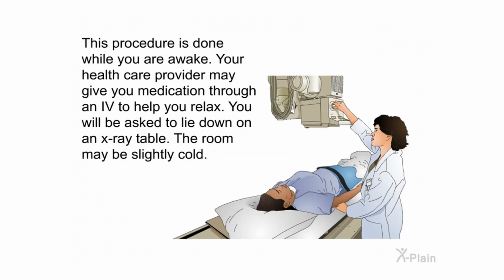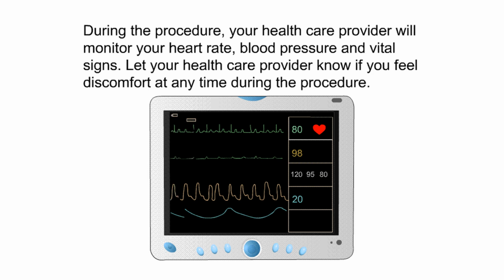This procedure is done while you are awake. Your healthcare provider may give you medication through an IV to help you relax. You will be asked to lie down on an X-ray table. The room may be slightly cold. During the procedure, your healthcare provider will monitor your heart rate, blood pressure, and vital signs. Let your healthcare provider know if you feel discomfort at any time during the procedure.